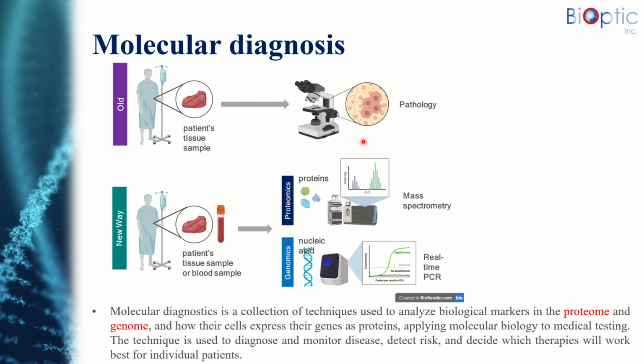With the advancement of molecular biology, many current diagnosis and analysis have been improved. Molecular diagnosis is a collection of techniques used to analyze biomarkers in the proteome and genome, and also how cells express their genes as proteins. We use molecular biological technology to monitor disease, detect risk of infection, and decide which therapies will work best for individual patients. It provides fast and high accuracy results.